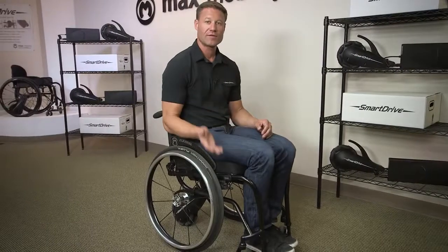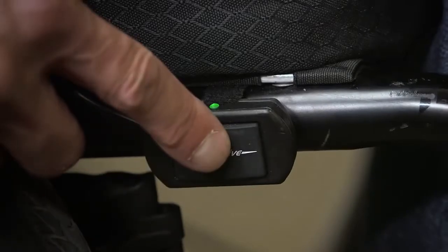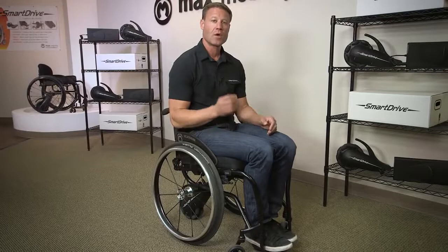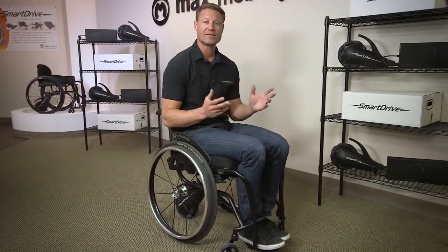As I mentioned, to turn off the SmartDrive, just press and hold for 1 second. The light will go off, you'll hear 2 short beeps. Once off, the SmartDrive will be passively following you around. The wheel has no rolling resistance, so you can freely push without it affecting your mobility.